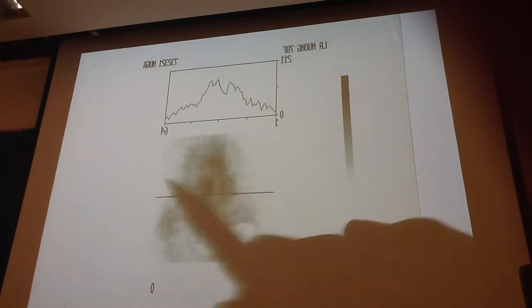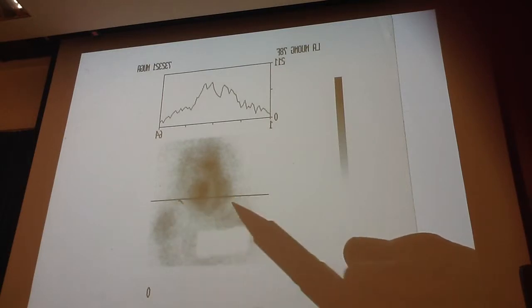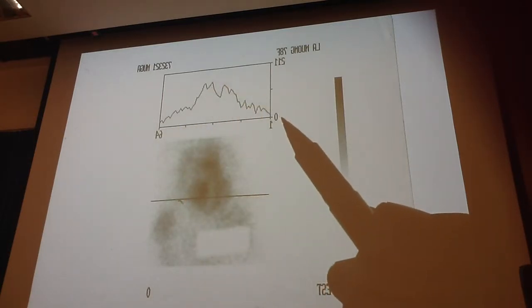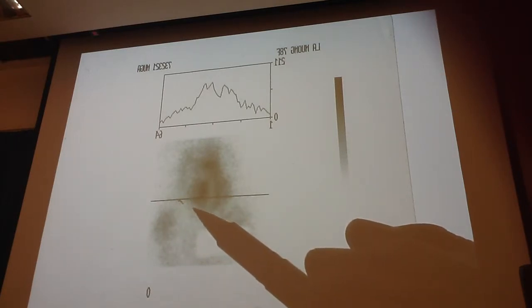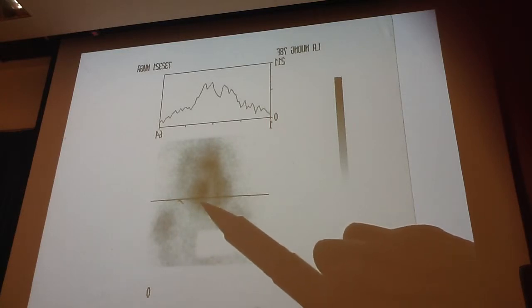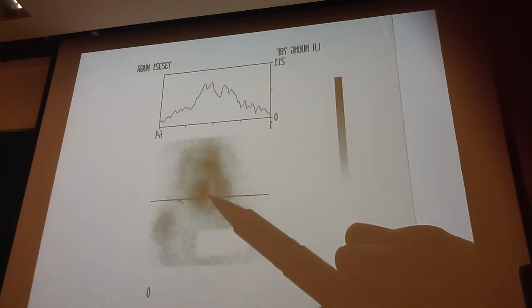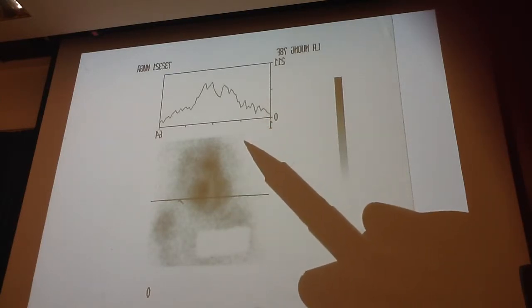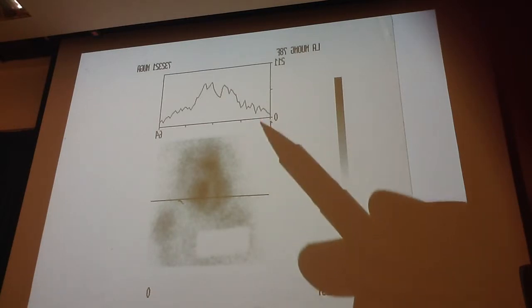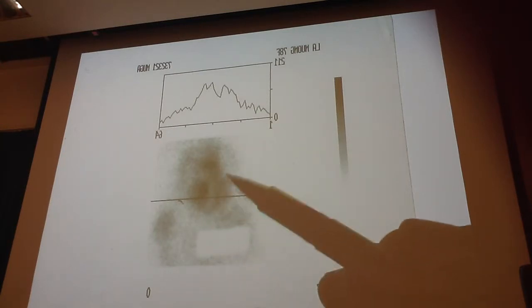So there's 64 horizontal lines, 64 vertical lines, and this is what the modulation, well actually this is called Fourier transform. Fourier transform is a mathematical process. It was originally designed for astronomy, but this guy, Jean-Baptiste Fourier, back in the 1700s, he's the guy that came up with this. He was using it for calculating planetary movement. And I guess it didn't work, so he went out and got drunk and never did anything again. But this is what created the basis for all medical imaging.